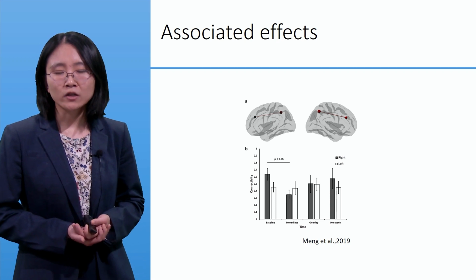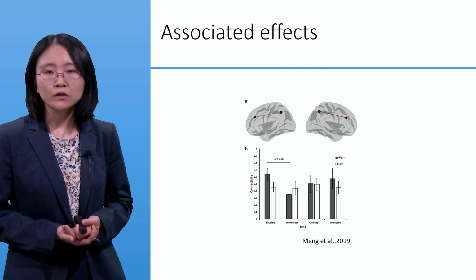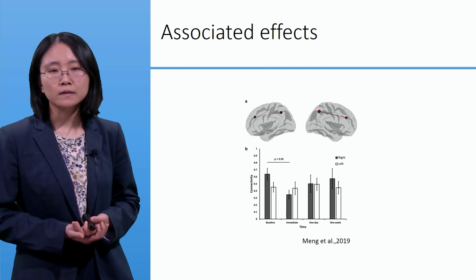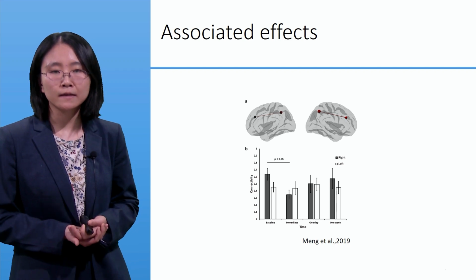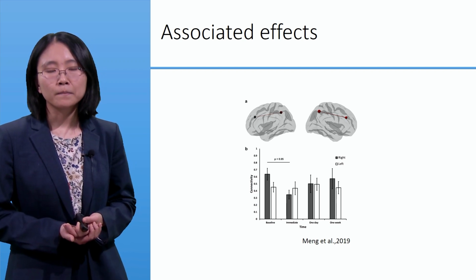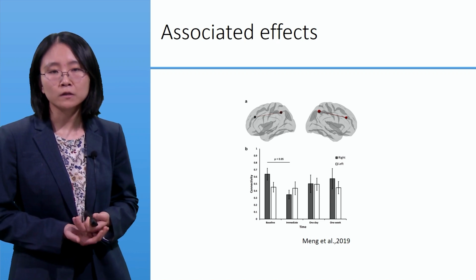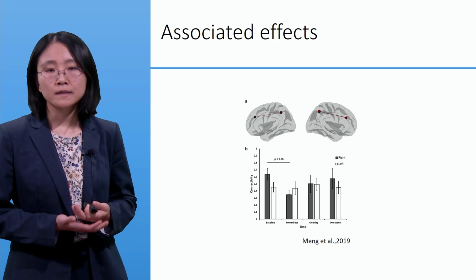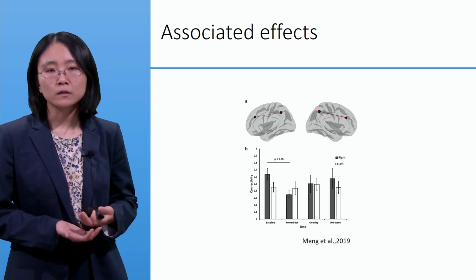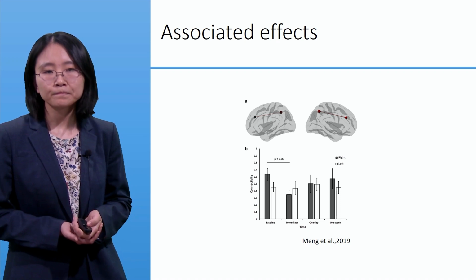So this study suggests that yes, blood-brain barrier opening does alter function at some level. That is an area where we need better studies to understand this. And in terms of safety, it's encouraging that the functional connectivity does recover long-term, which assures us that a single BBB opening does not have any long-term untoward effect in patients with Alzheimer's.